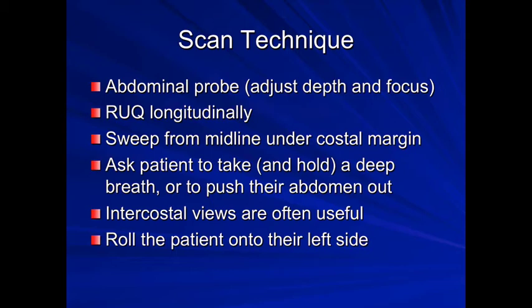Alternatively, in particular if the patient can't hold their breath, if we ask them to push their abdomen out, then that also will help depress the diaphragm and push the liver down. If the liver sits very high up under the costal margin, or if there's a lot of gas about, then sometimes we can use an intercostal approach with the probe aligned along the line of the ribs.